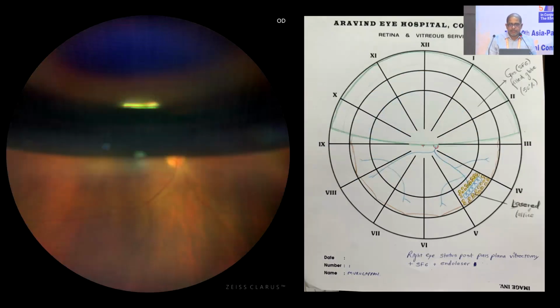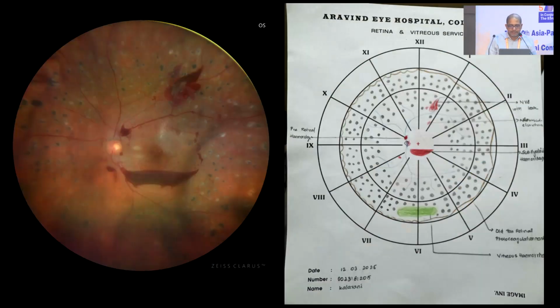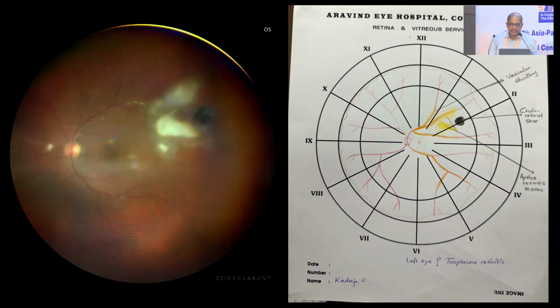And this is a post-operative gas inside, so you have to put it in green. Any vitreous opacity should be in green, and inferiorly you have the barraged lattice. And this is a preretinal hemorrhage in a patient with NV, and a preretinal hemorrhage in a patient with PDR which has been already lasered.